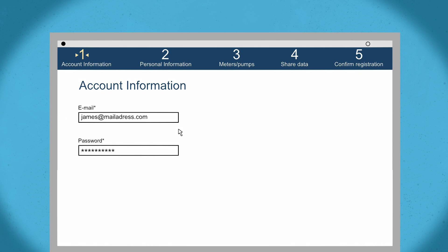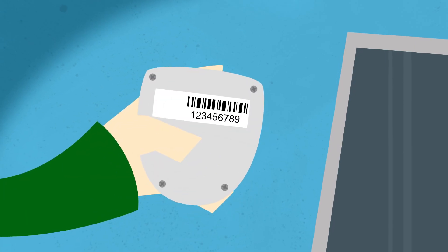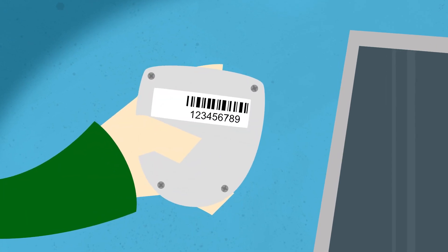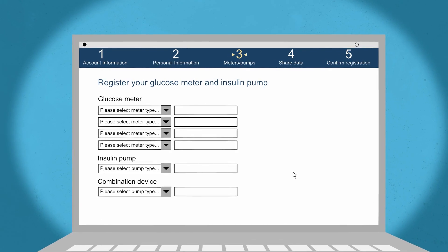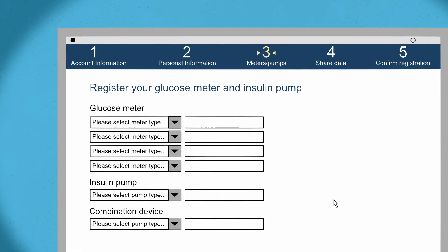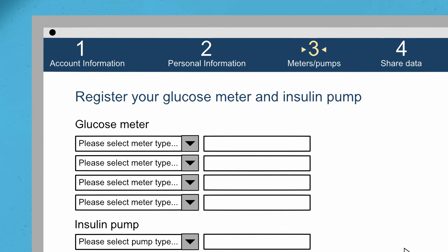Please note that the email address you register will also be your username when you log into Diacend. Please have the serial numbers of your device or devices ready as well. If you do not register your serial number during the registration process, you can add this later. The serial number will automatically be added into your account when you upload to your Diacend account, or you can add it manually.